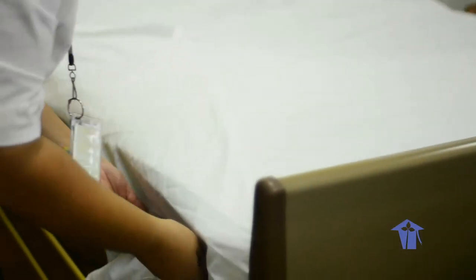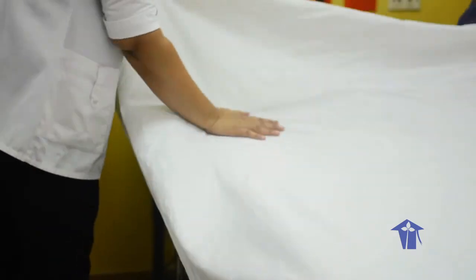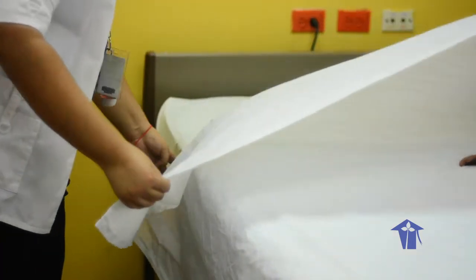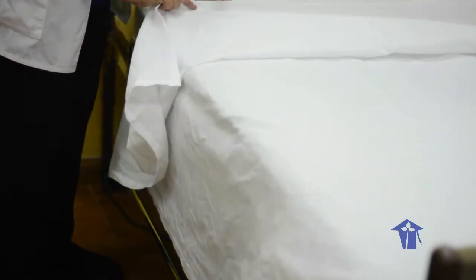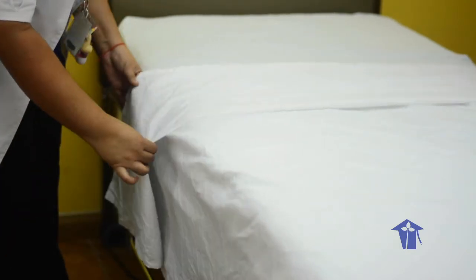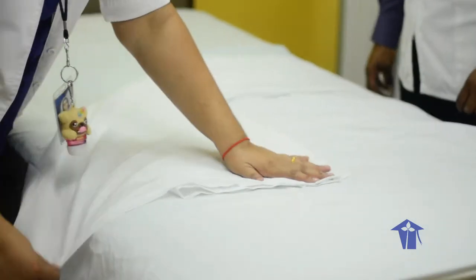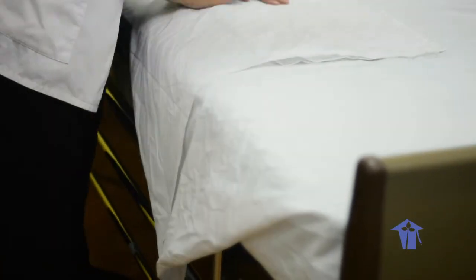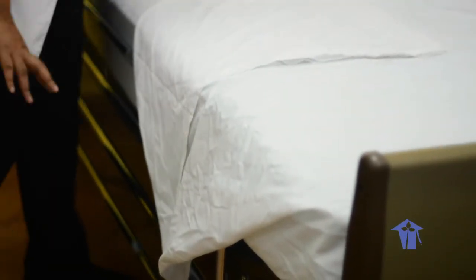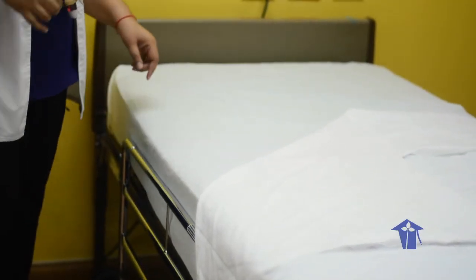So all we do is mitre, leave this, bring it down. This is too long, you can bring it back up, right? And because the patient is coming in from my side, I'm going to open the bed, so they know that this is the side that the patient will come into. Okay? So this is called an unoccupied bed.